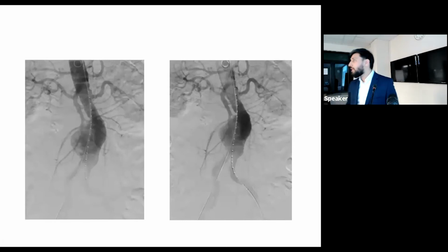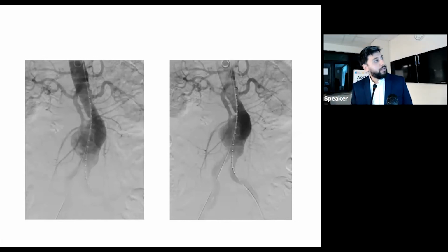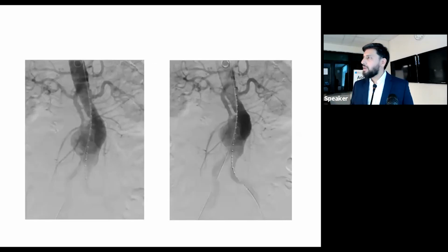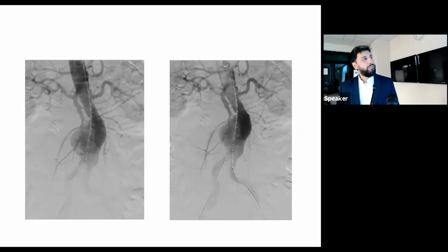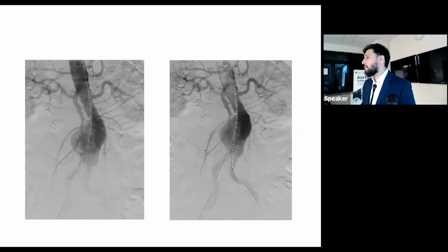So this is during the endovascular aneurysm repair. We always do an angiogram, and oftentimes we do the first angiogram with the main body graft up, because it's a stiff structure and can change how things look. But here we wanted to address that IMA first.